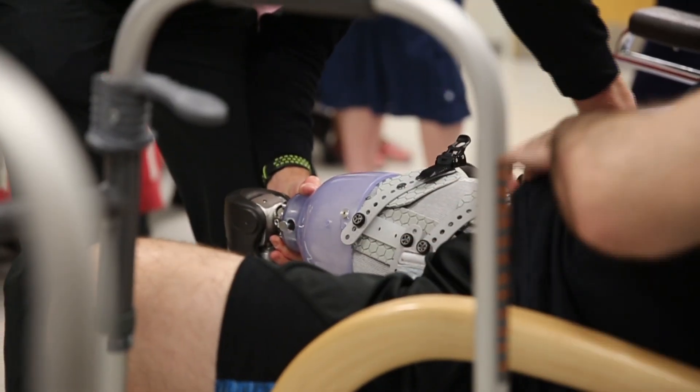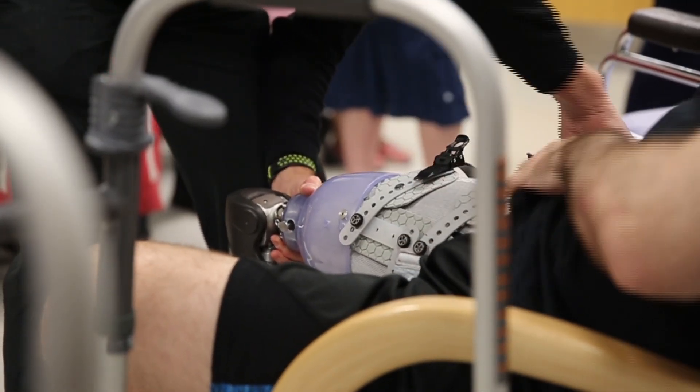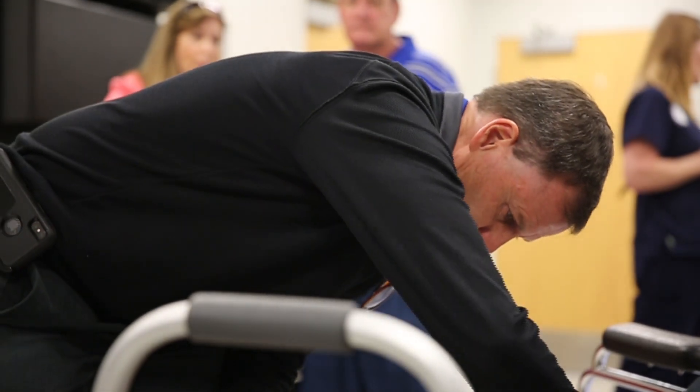We're very excited, grateful, and thankful to be a part of this. It's very groundbreaking and life-changing for Daniel, because he's been through about four sockets now due to comfort and fit issues.